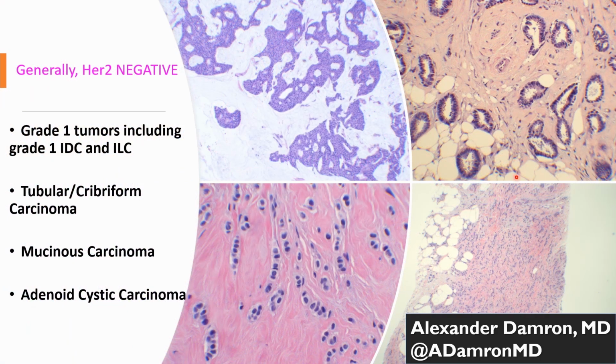Other morphologies that you wouldn't expect to be HER2 positive is a mucinous carcinoma, right? And that's a pure mucinous carcinoma. I'll show you another thing like mucinous and micropapillary carcinoma, but really mucinous carcinoma that fulfills that criteria of being, quote, a colloid carcinoma is generally going to be HER2 negative. Again, there's another tubular carcinoma picture.